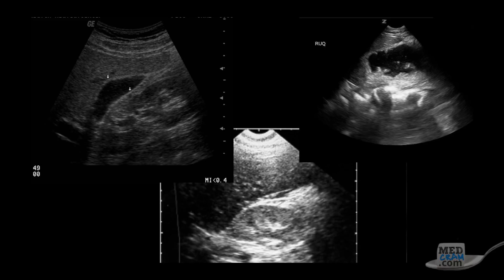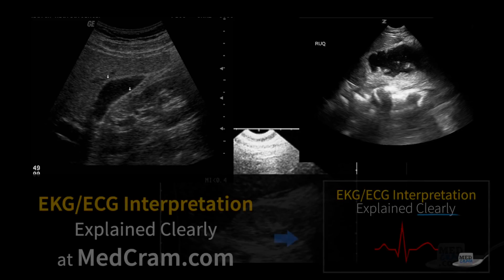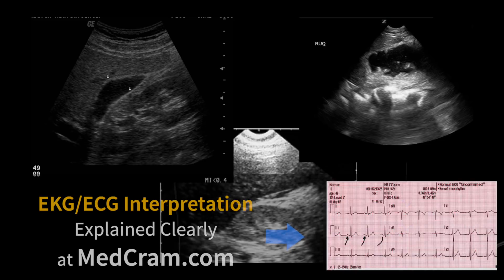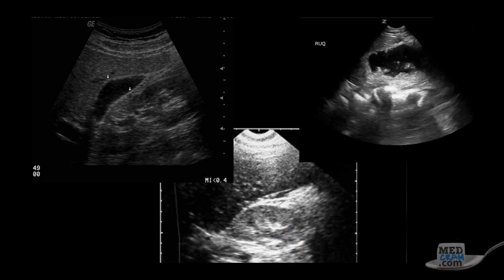Those were all true positives. There are false positives and pitfalls in the right upper quadrant. First, the gallbladder: we see an echogenic wall surrounding it in a pear-like shape with fluid within it. But as discussed, this is fluid within a container — it takes the shape of the container and has an echogenic wall surrounding it. If you aim too anteriorly in the right upper quadrant, you'll see the gallbladder — this is not free fluid.